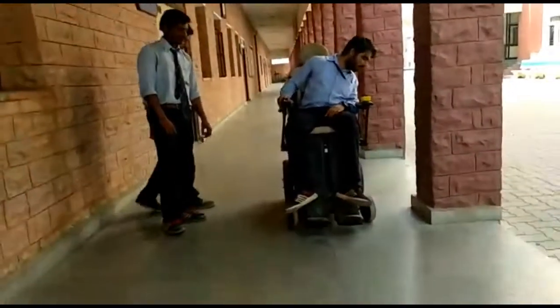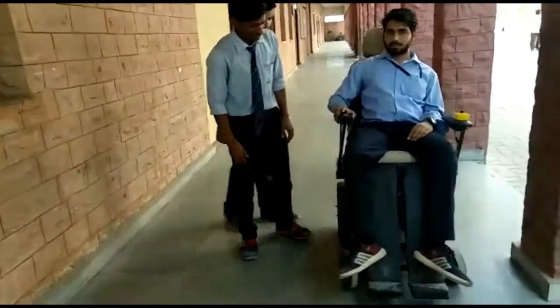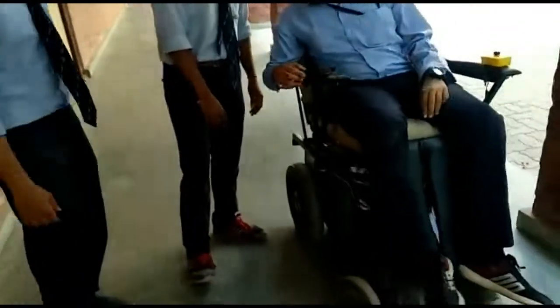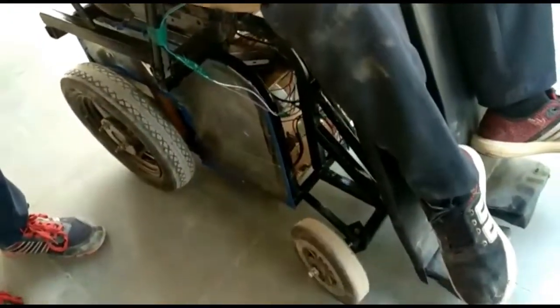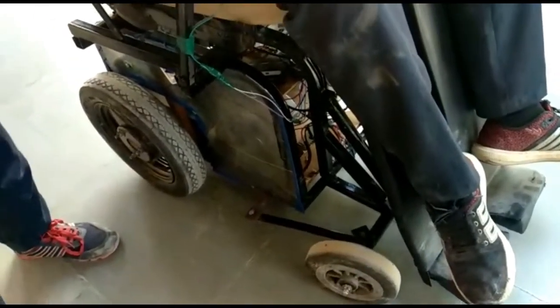Now we show you the mechanism for steering. The wheelchair is steered with the help of the joystick. This is controlled by the joystick, and the mechanism is covered by Naveen Kumar.